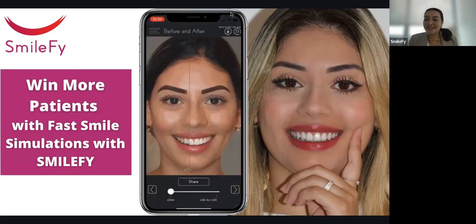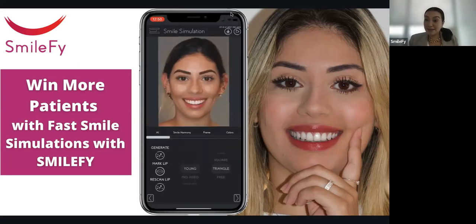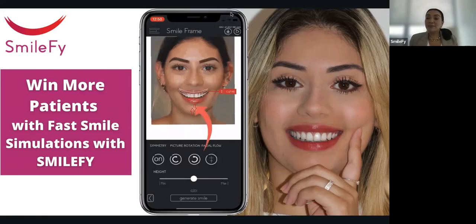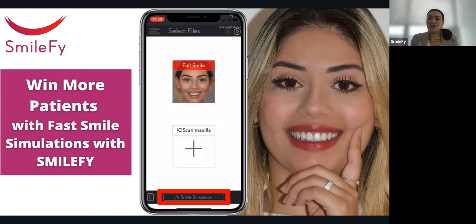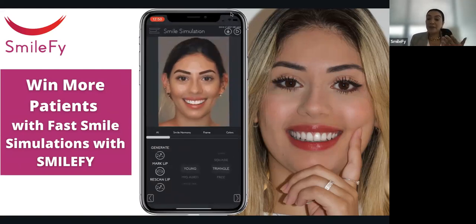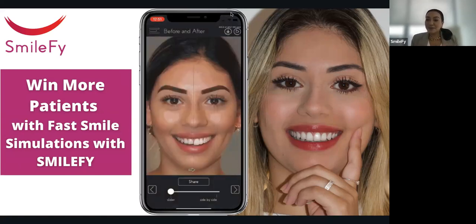Can you believe this is the same person? This is the same person. She came to the office. She's one of our successful cases. She's 22 years old, feeling bad about the gaps between the central incisors. She felt that her teeth were too short, and we did a smile simulation. Of course, she's super young, so she did ortho and a gingivectomy. We didn't do veneers, we did injectable composite veneers, but look at the difference.